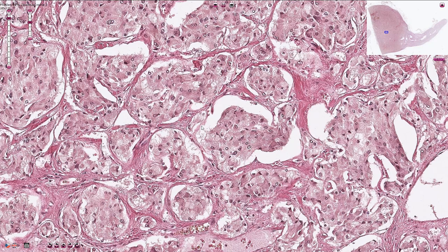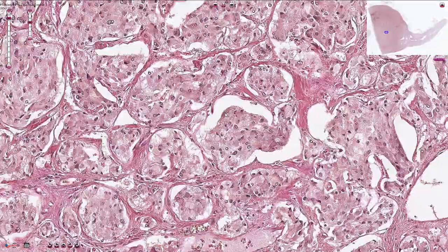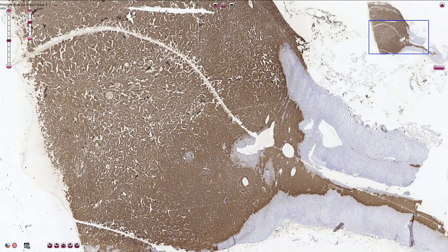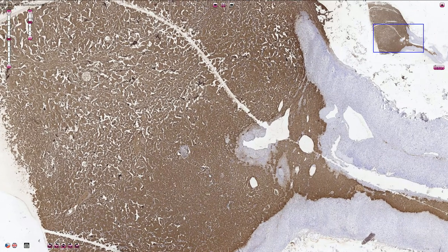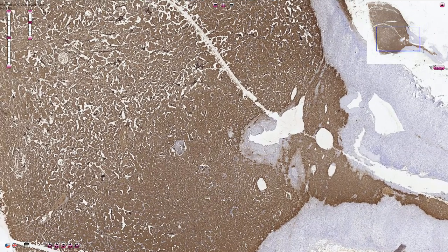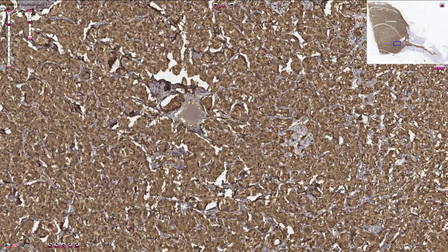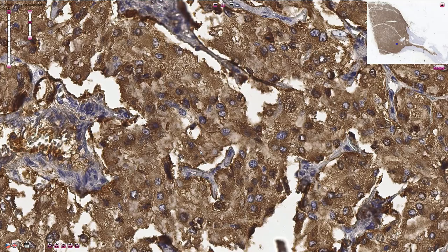Apart from neuroendocrine cells, we also have small spindle sustentacular cells. They are not visible on H&E stain — we need to use the S100 immunohistochemical marker to actually see them. This slide is stained with chromogranin A, a neuroendocrine marker. We can see that both the tumor and adrenal medulla are positive, and at higher magnification the cytoplasmic positivity is stronger in some cells and weaker in others.